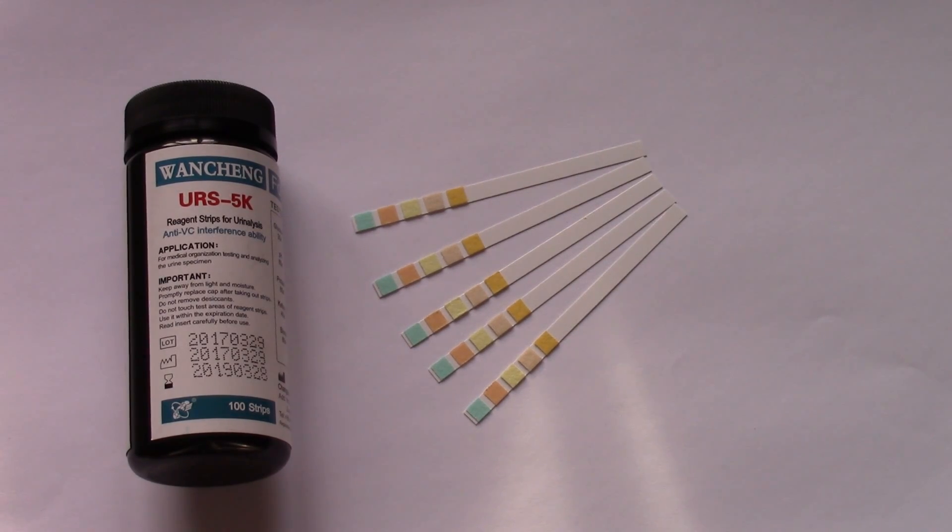A 5K product means it's got five parameters or five pads on it and the K refers to ketones because you can have different combinations of five on these. A 5K is a good combination because the combination of tests allow you to screen for quite a few things, common things that you're going to be interested in buying a test strip for.